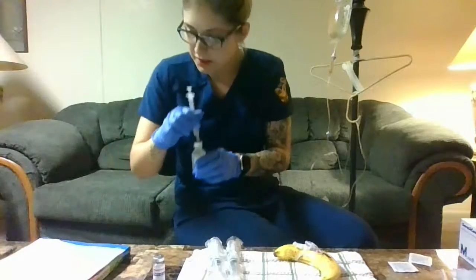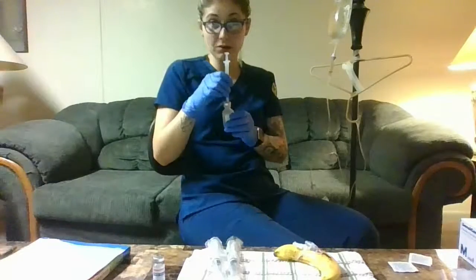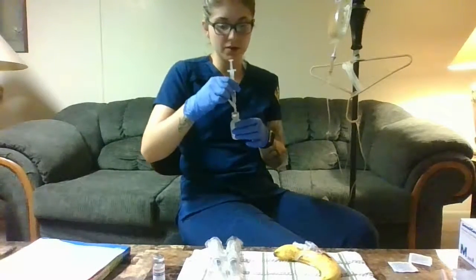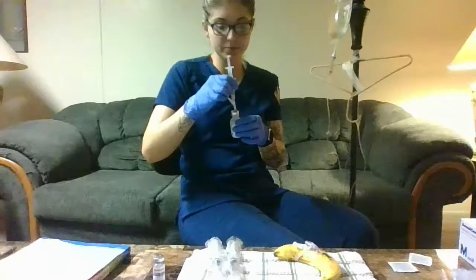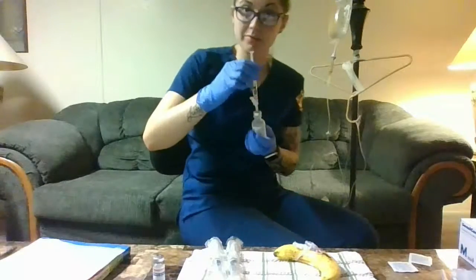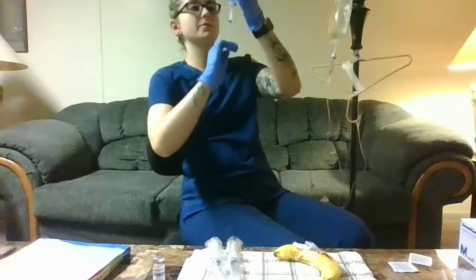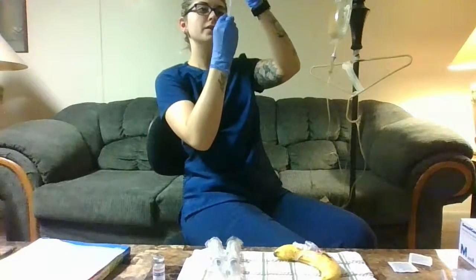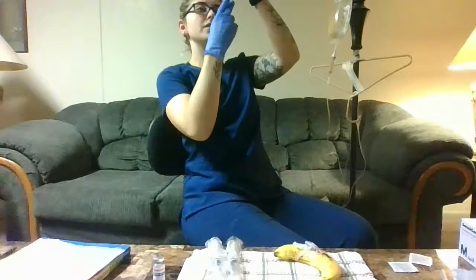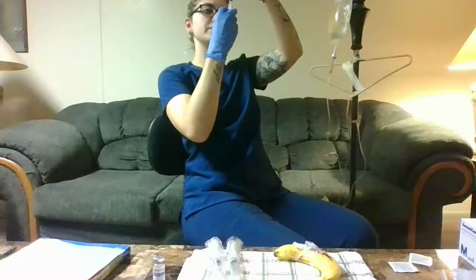Okay, and so then that is all mixed together. And then we need to take out 3 milliliters of this solution. Kind of roll it a little bit, mix it up, and then gonna flip it upside down, take out the 3 milliliters.